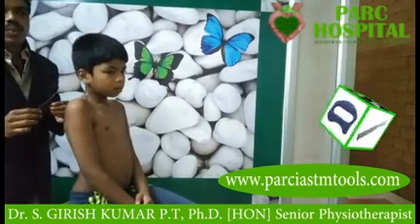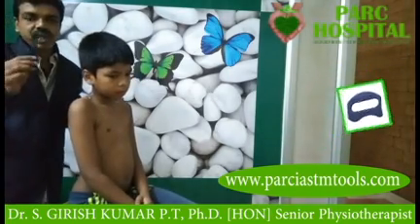This Parc IASTM tool will be so worthwhile for every physiotherapist.